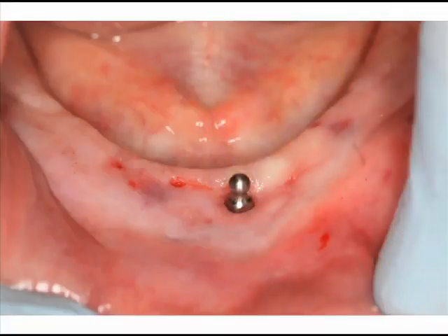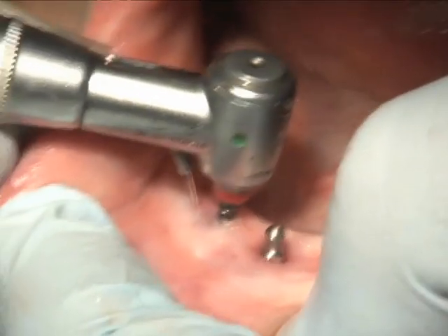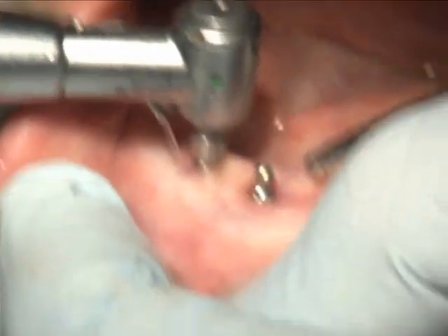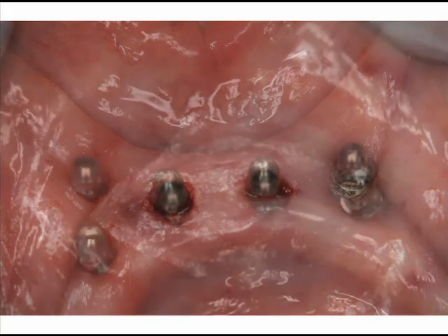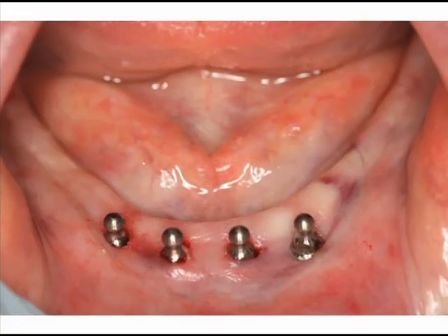Figures 30 and 31 demonstrate the placement of the first implant in proper position intraorally and radiographically. Subsequent implants were placed using the same protocol. We also want to try to parallel these implants, but again, the direction and the placement of the implants was predetermined using the CT scanning software. 1, 2, 3, 4 of the implants are placed. Figure 49 shows the occlusal view of the implants following the arch. Figure 51 demonstrates a facial view of the O-balls intraorally.